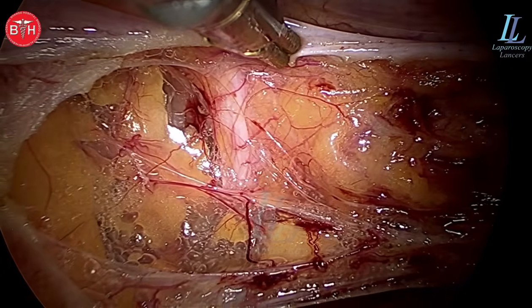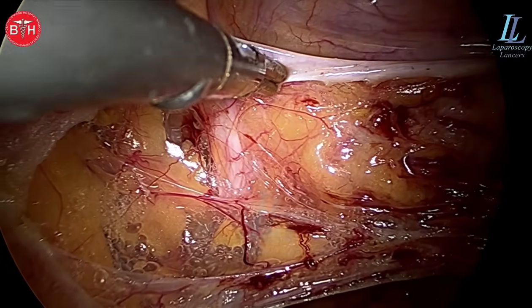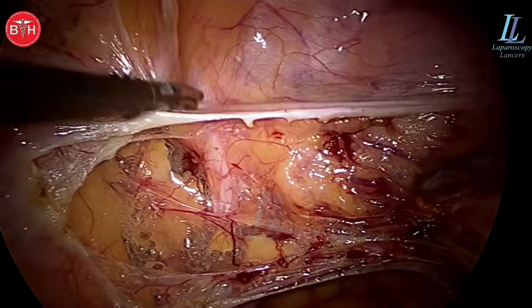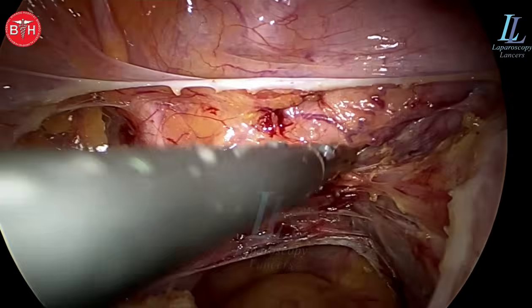Look how far away the ureter is from the dissection site. So you do not have to worry about the ureters at all. Most gynecologists fear about the ureter — please do not fear. Stay close to the uterus.